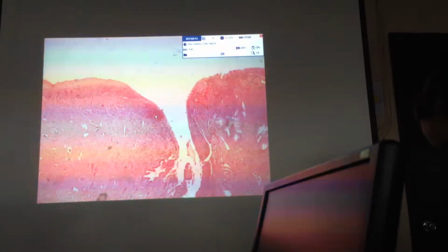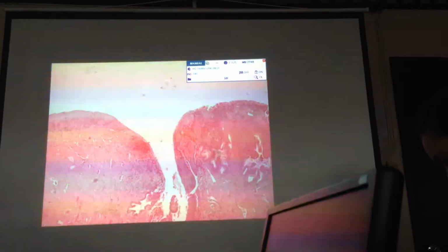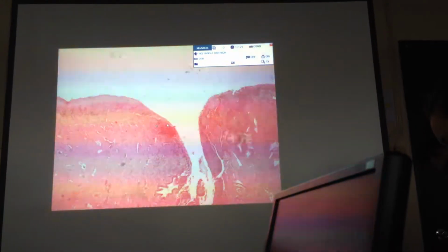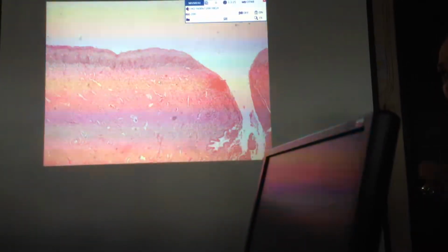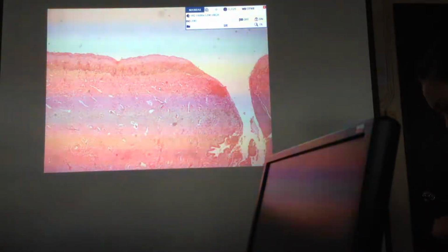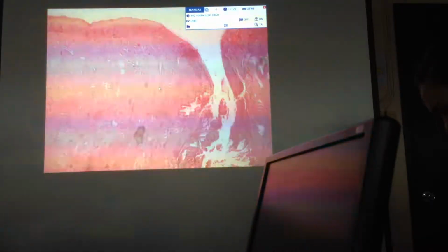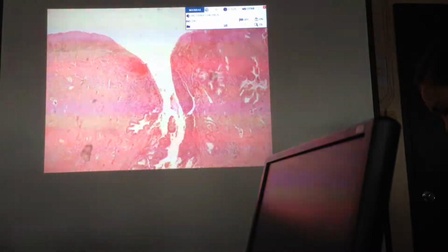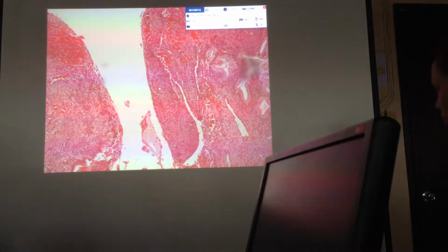Carcinoma in situ of the cervix. So when we do the cervical biopsies, usually we look into the presence or absence of atypia in the cells. So the majority of cases that we have would be more of inflammation. Usually we get chronic cervicitis in cervical biopsies. And then we look for any signs of atypia in the cervical epithelium.